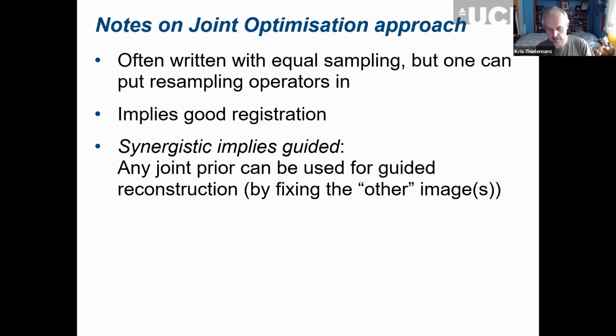So, yeah, I think if you do joint optimization with one update, then you need to think very hard about preconditioning. Otherwise, it's not going to work. Okay, thanks.